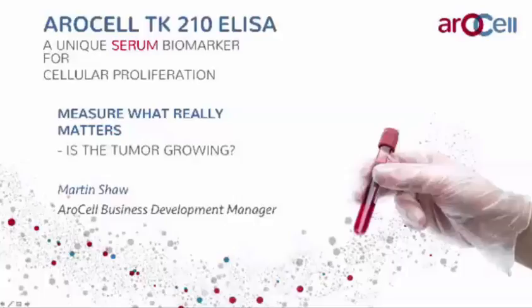Okay, thank you for this question. It's a good one. So this is Staffan speaking. I think it's clear that there are several different sources. Actually, all rapidly proliferating cells in the body will provide some TK into the blood. And it is also so that things like inflammation or an active form of infection will increase the TK, but only temporarily. So for being specific for tumors, it's really the stable high level of TK that is the biomarker for a tumor, and this is a very specific process that can be used clinically.